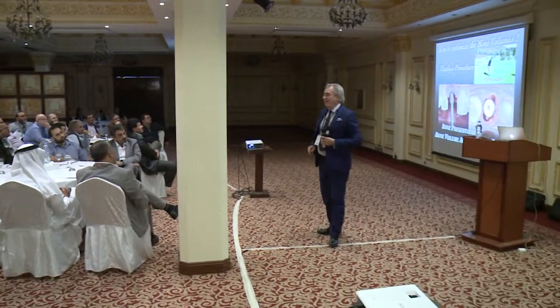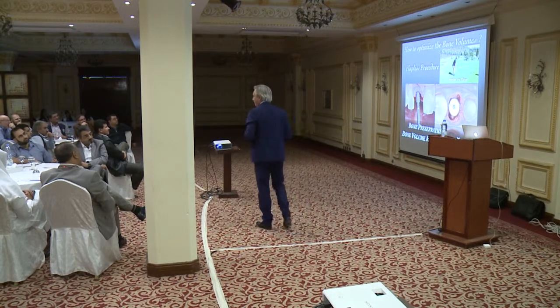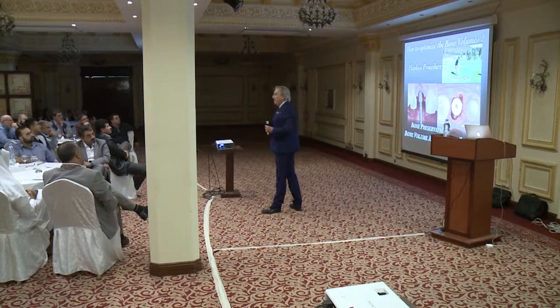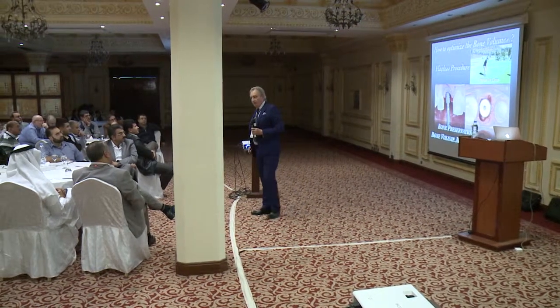At least 96%. The main problem is represented by lack of bone. It's not the only one, but this is the main problem. And this may be a solution, but we will need to optimize these bone volumes.